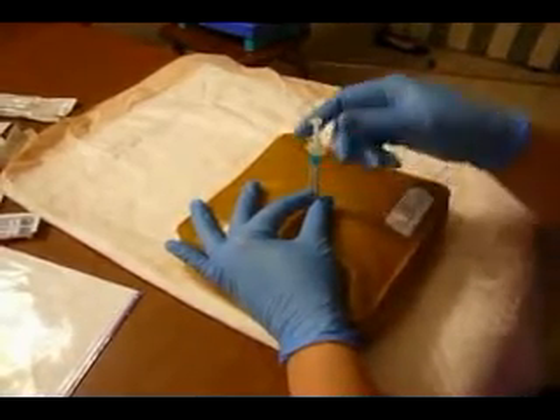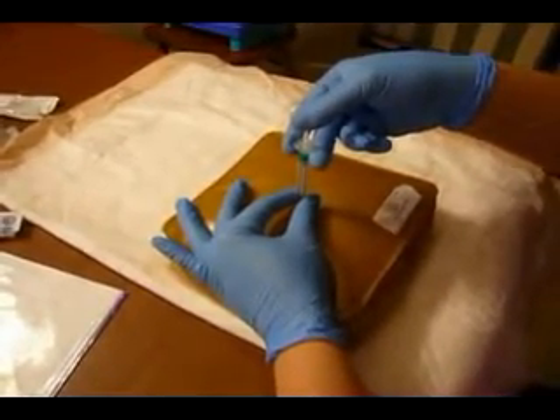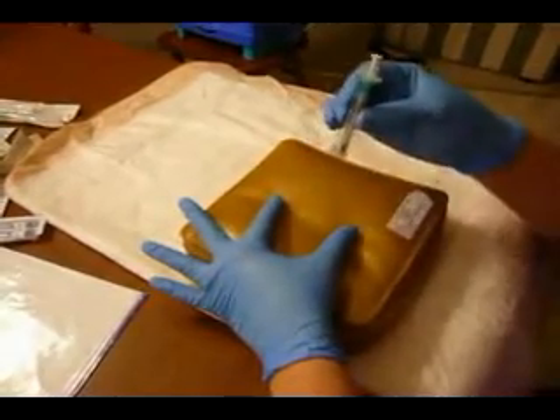I'm going to insert in and stabilize the syringe with my thumb and forefinger. I'm going to inject — you can either use your finger or your thumb. You inject slowly over three to five seconds. Once the medication is completely in, I make sure I stabilize again with my dominant hand, bring my thumb and forefinger out, and remove the needle.